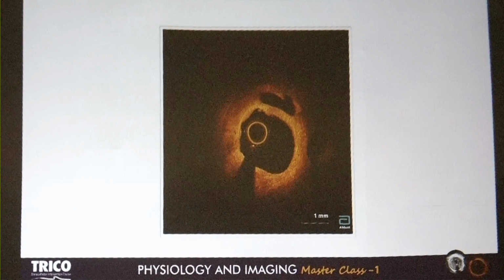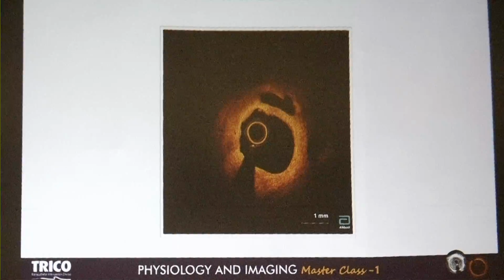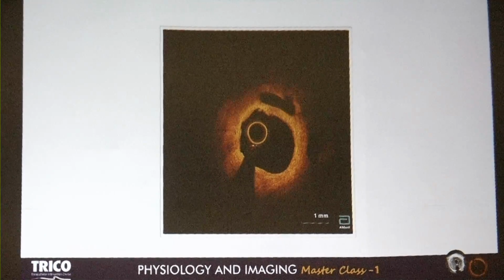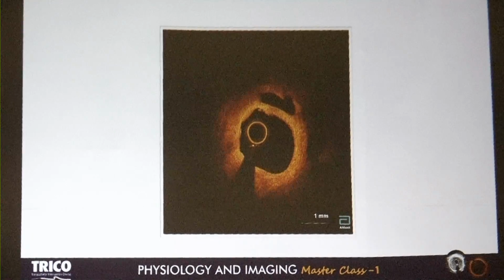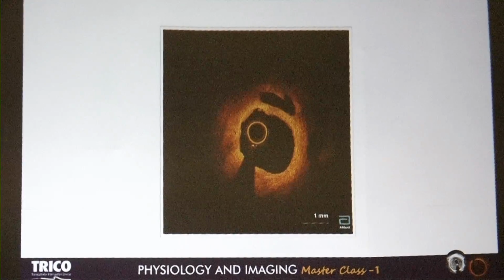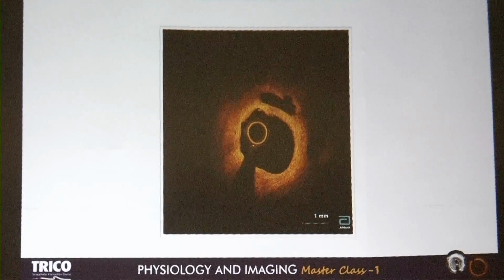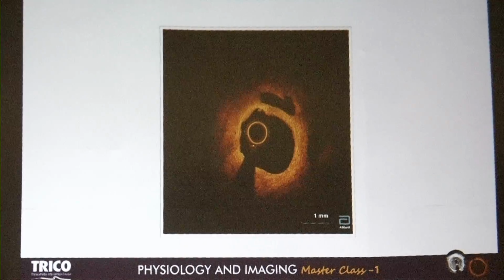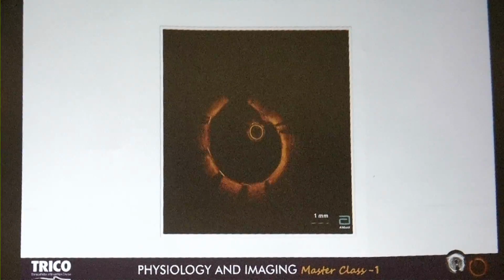So we have published. And then I had to deep intubate my guide a little bit just to push my balloon in. It was difficult. Professor Patel tried to make a 3D reconstruction. Okay, you can identify. Oh, that I forgot. Now I have this data available. We'll make a 3D reconstruction. Great. So this is what we saw. Dr. Tejas, this is the result.